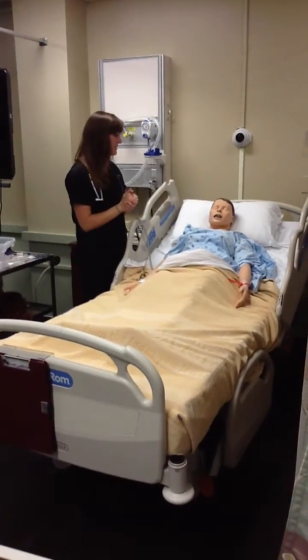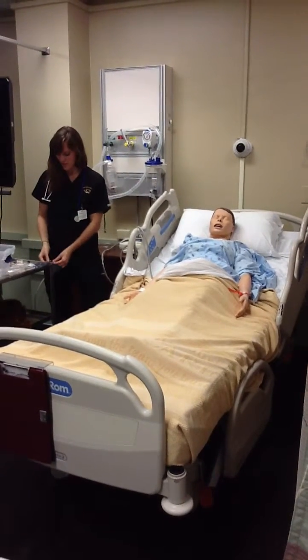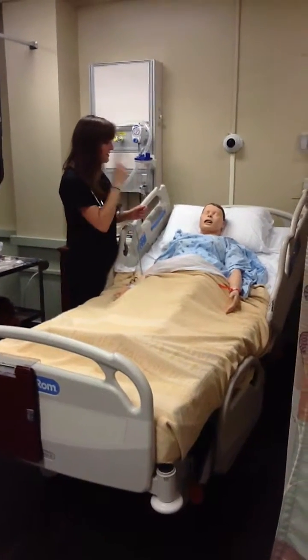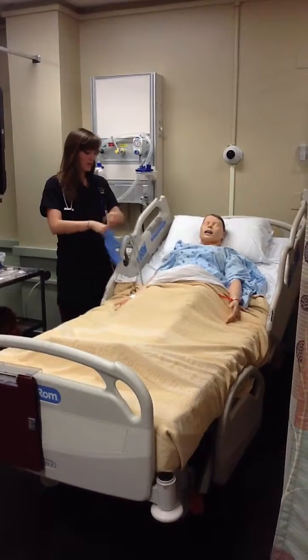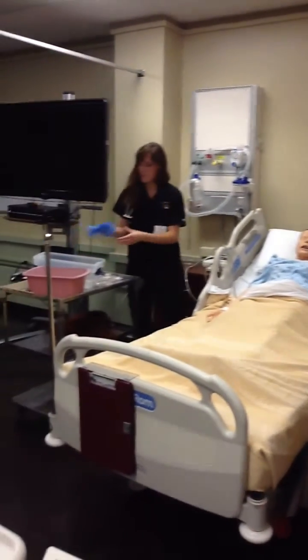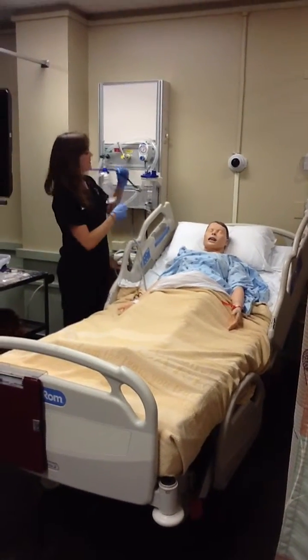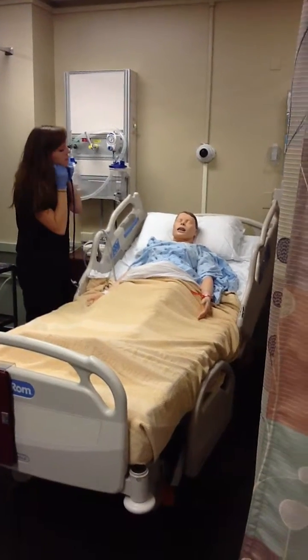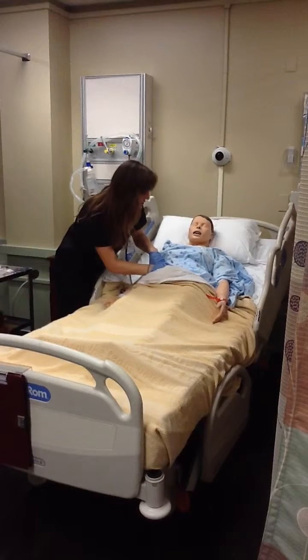Your health coach team and I have decided that since you are having a little bit of difficulty swallowing and you're not getting the nourishment that you need, we're going to place you on a nasogastric tube. That's just going to be a small tube that goes in through your nose and down into your stomach, and we're going to be delivering tubing to you this way. The first thing I'm going to do is just listen to your bowel sounds real quick, and that is just going to show us that you are not having any blockage — that food you are consuming, you are digesting.